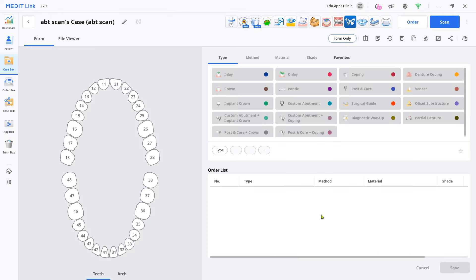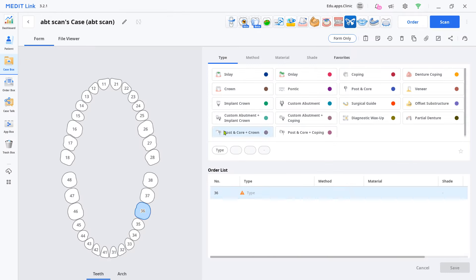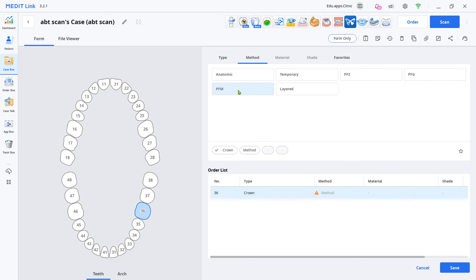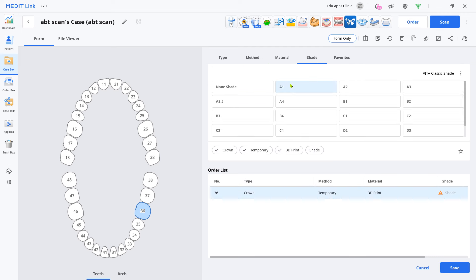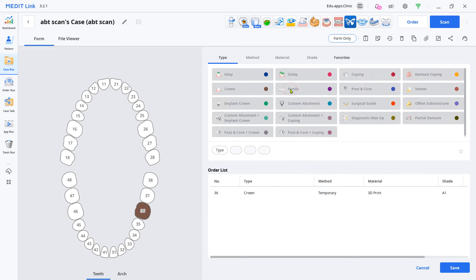Choose the target teeth number and then select crown, temporary, and shade. Have your scanner ready and click scan.